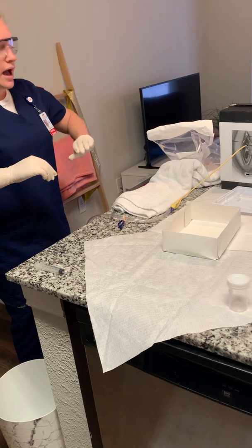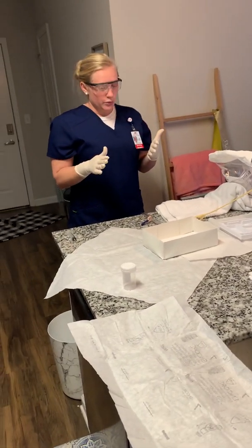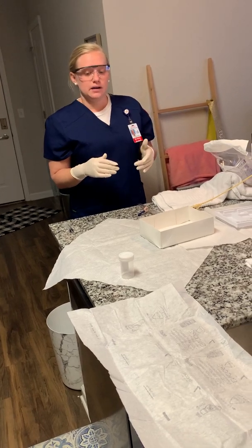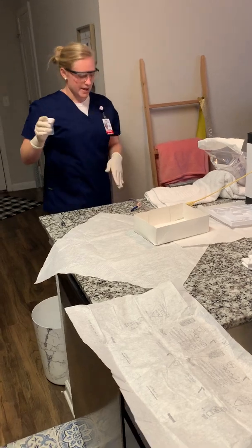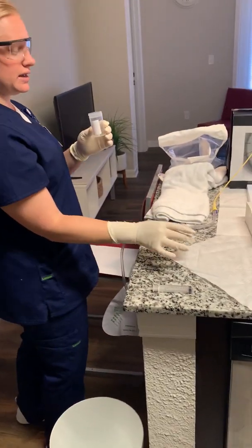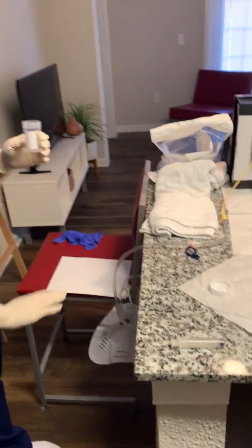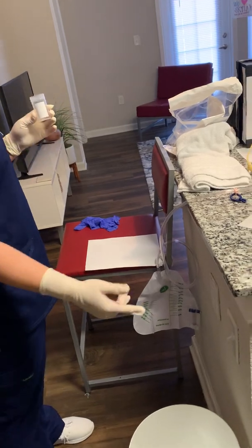Okay, so now I'm going to collect the specimen. If you want to collect the specimen just after you insert the catheter, you're going to use the bag. So I'm going to open this container and put the cap down here. I would have a towel and a container under the bag just in case there's any drippings.